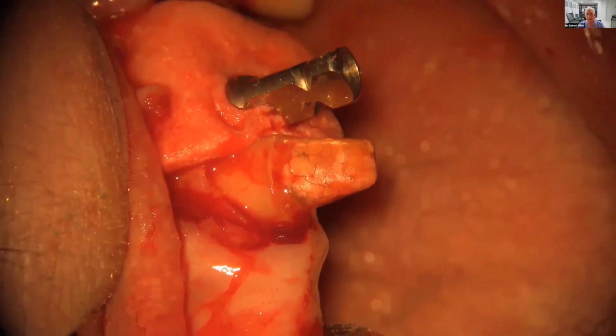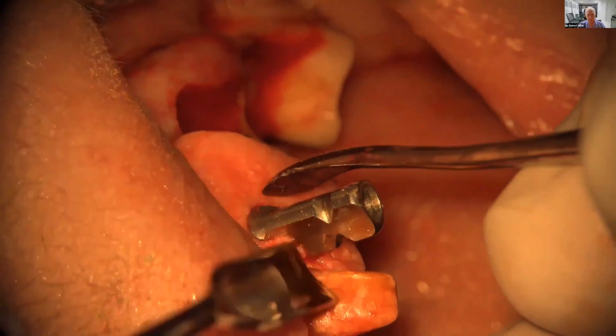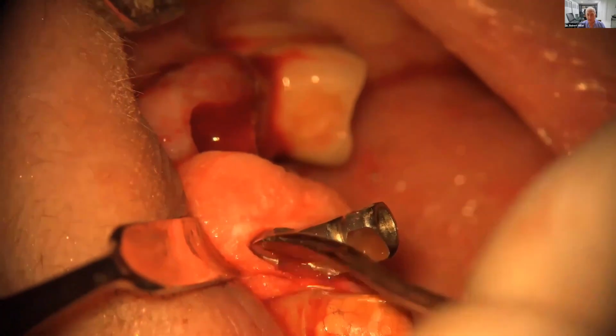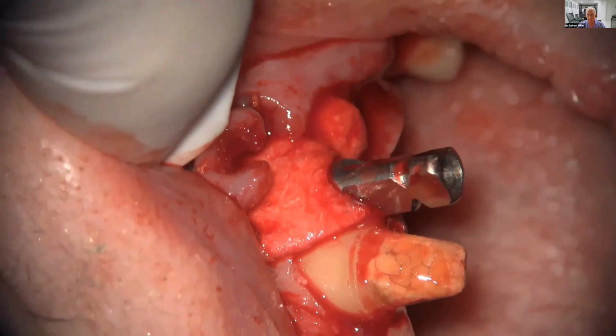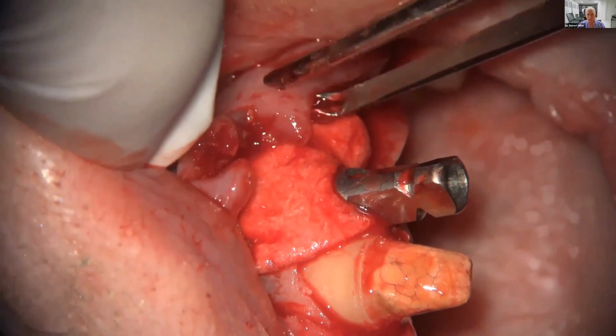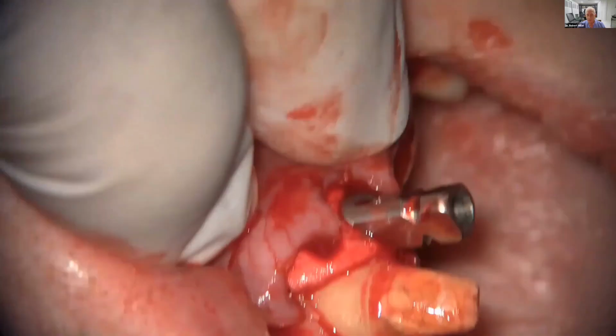And then it's very easy to co-adapt those flat margins. But the beautiful thing about this is that this material will not migrate. It's got really good body to it. You just shape it, mold it into the position that you want. You then reposition your flap over the top of this, and these cases heal beautifully.